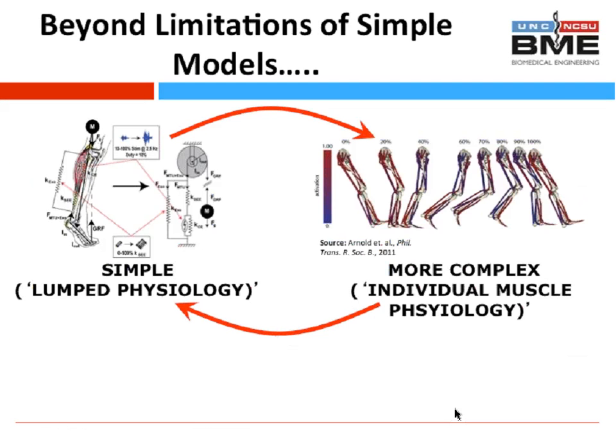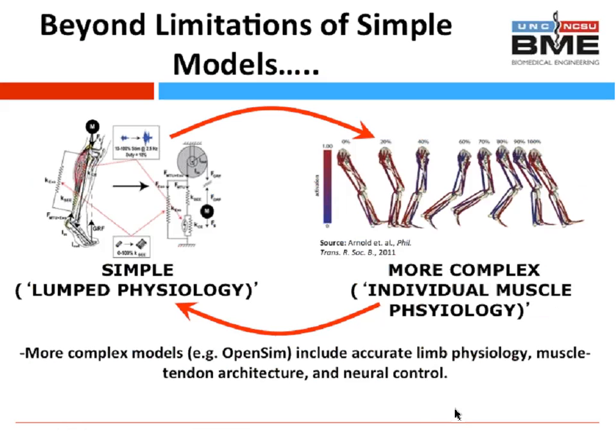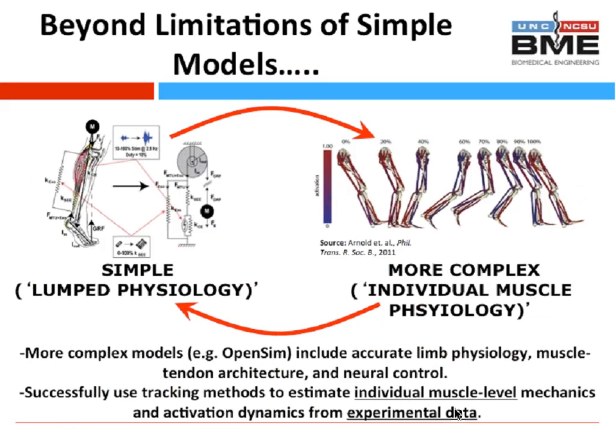So just to sum up here before Dom takes off, I guess what I'm saying is simple models are a good way to sort of orient ourselves in the larger design space where it might be difficult to make laboratory measurements at every one of those grid points. However, there are a number of simplifications in this model that keep us from getting a real good understanding of what's happening underneath the skin.